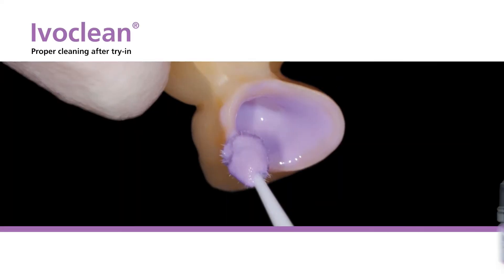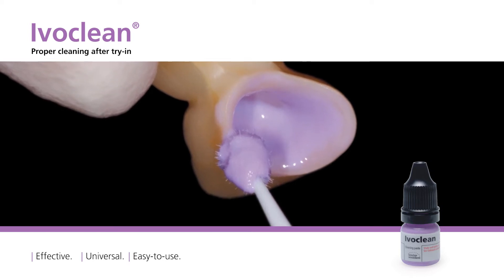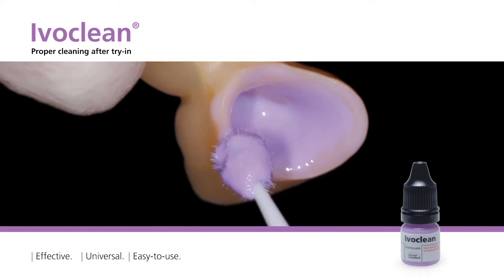IvoClean is an effective and universal paste designed for cleaning the bonding surfaces of prosthetic restorations after try-in. Find out how to clean the bonding surface with IvoClean.